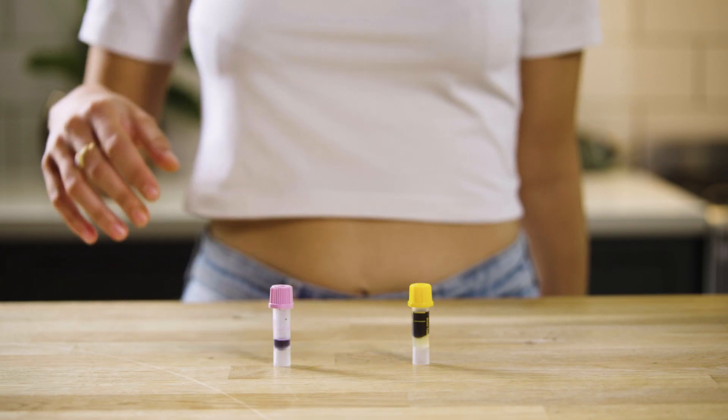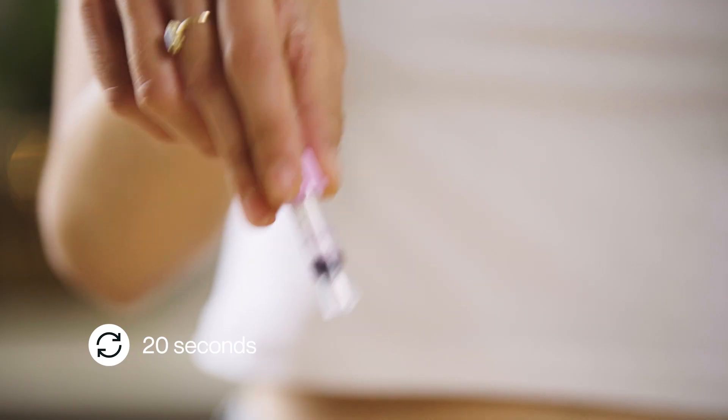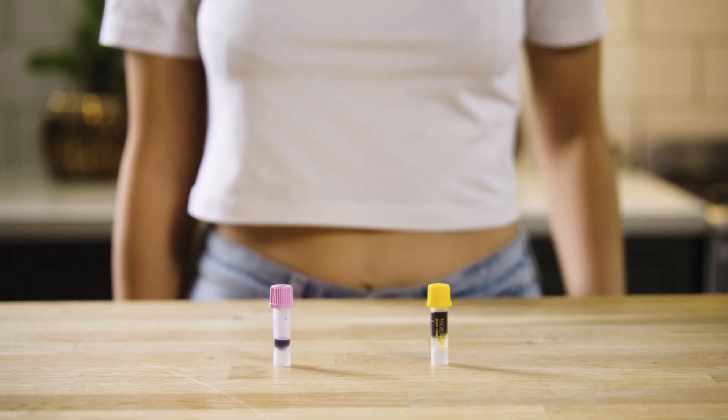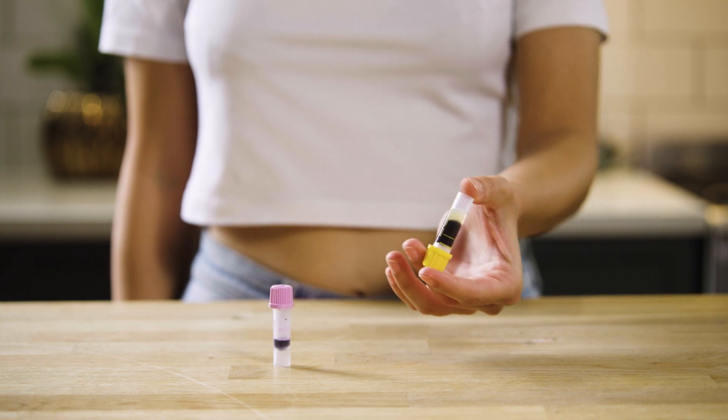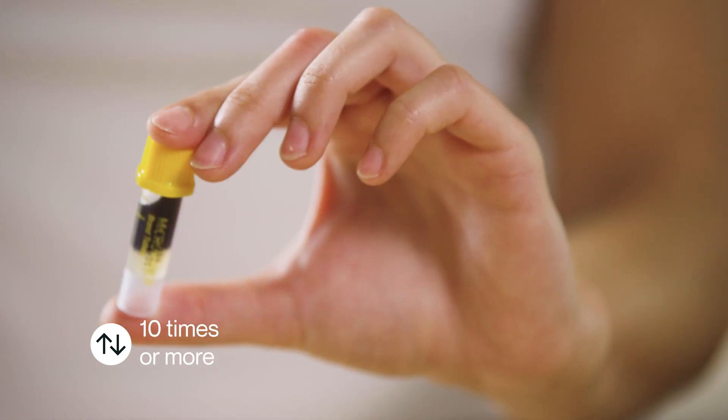If you have a purple tube, start with this one. Gently swirl the purple tube for 20 seconds, making sure the blood touches the sides — the blood should remain liquid. For the yellow and orange tubes, gently turn them upside down at least 10 times. The blood inside will thicken, separating from the yellow gel.